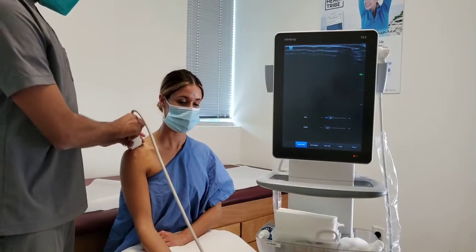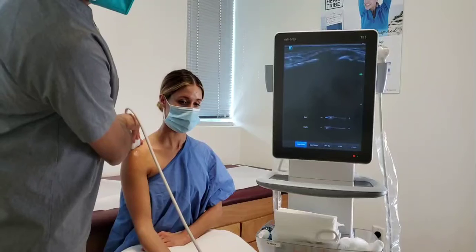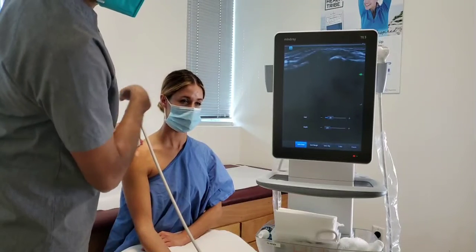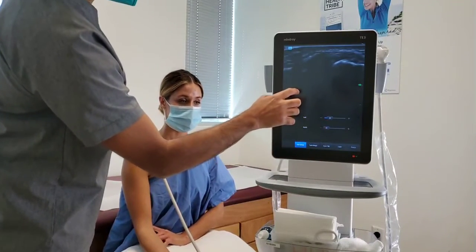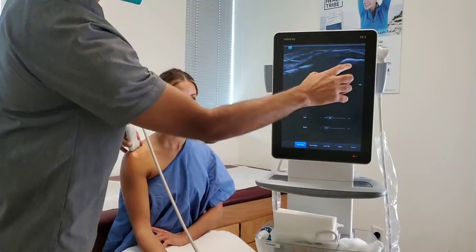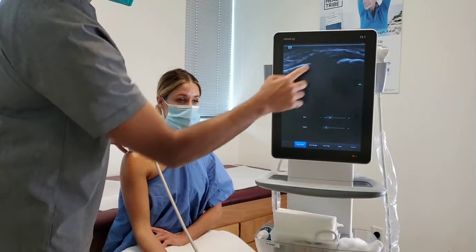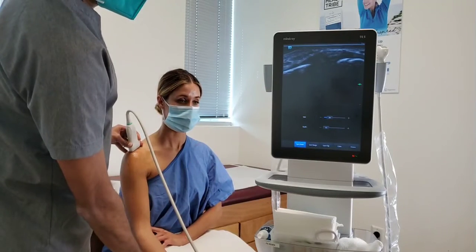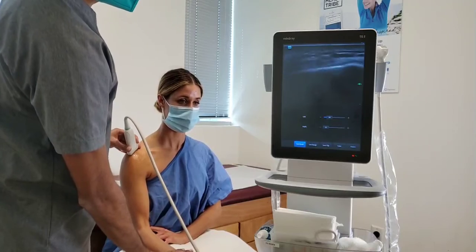From here, I go up to what's called the AC joint. The AC joint, you can see at the top of the screen here, is where the collarbone, right here, comes and meets the tip of the shoulder over here. And the space between the two bones is the joint. You could push your hand up for me, and you can see how that moves a little bit.